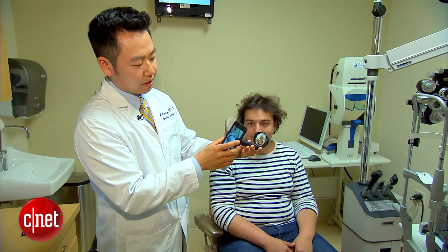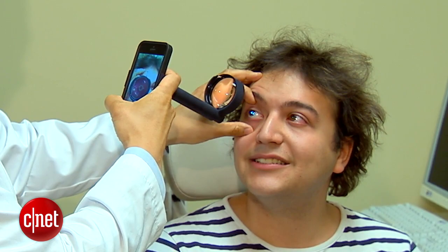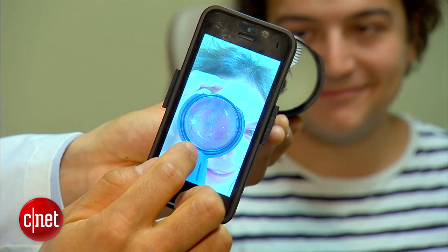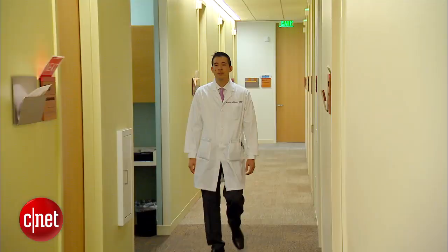The lens is held in front of the phone at the prescribed distance, and it takes up the center of the screen. Now we're ready to take a picture of Alex's eye. You can see his optic nerve right in the middle — or actually off to the side — and then there are vessels that come off of it, and here is his macula. This is what we call the posterior pole.